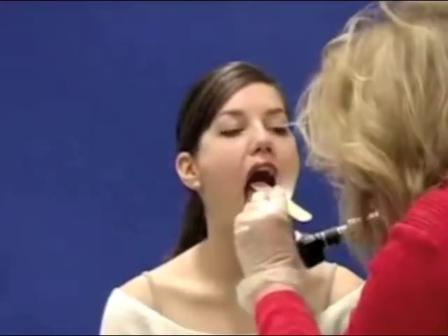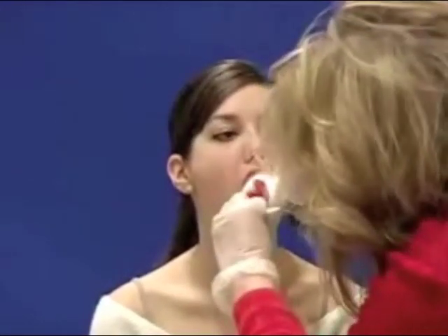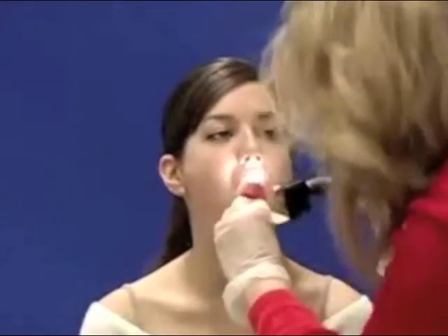Okay, now watch how patient this girl is as she gets the tongue depressor used on her. She does exactly what the doctor says, and it's great how the doctor is wearing gloves. That way you know the doctor's taking care of themselves and the patient. So just watch how this kind of works, and that way you get a great idea of the tongue depressor.